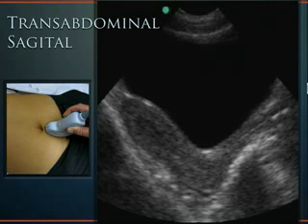Now, if I took the intracavitary probe, or the endovaginal transducer, and I insert it into the vaginal vault, I would eventually come to the cervix, and when I land on the cervix, that's when I stop inserting the probe, and the sound comes out over this whole area right here, and I get really high-res pictures of the uterus and the pelvic contents, because I've got that high-frequency transducer. So I'm just kind of throwing this all out there for anatomy and stuff.